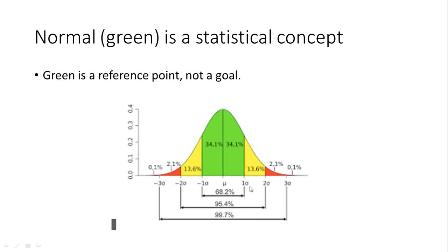Now, from a lot of qEEG people's perspectives, they're thinking somebody doesn't have any abnormal activity until you get outside of 2 standard deviations. That's such a small percentage of the population that that's where you would find abnormal behavior. Although that's true statistically, that's not necessarily true of a phenomenon's intrinsic nature. Most of the activity in the human brain occurs within the first 2 standard deviations. Most of the anxiety and depression occurs within 2 standard deviations.